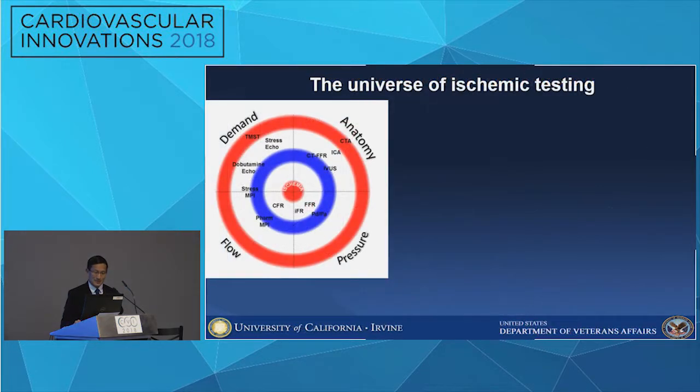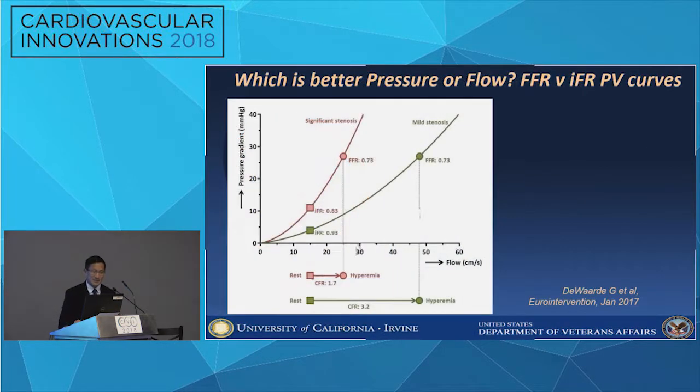We'll get to those. But yeah, this is a critical slide, and thank you for stopping me there, because this is where you're going to see the difference, and this is the only explanation they believe for why there's discordance, because of differences in adenosine responsiveness. What is happening to the CFR?